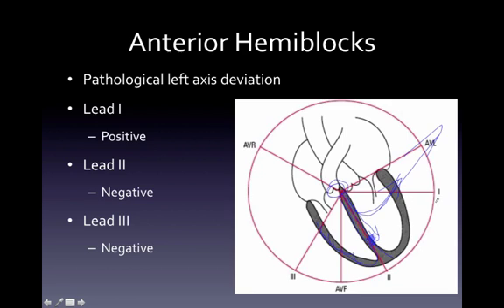So to each one of these leads, now remember these are positive electrodes. In lead 1, it's kind of headed in that direction, so it's going to be above the isoelectric line. In lead 2, the question is am I heading towards it or away from it? And the answer is I'm headed kind of away from it, so it's going to be below the isoelectric line.